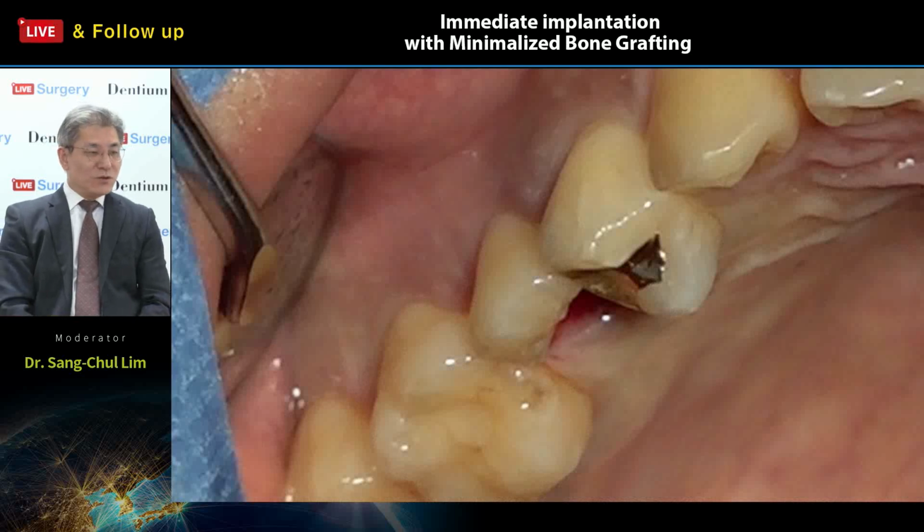Okay, let's move to today's surgery room. Dr. Chung is already prepared for today's surgery.